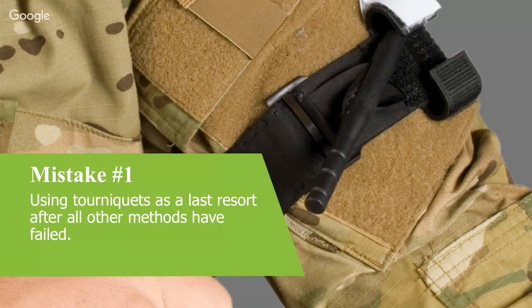And some guidance that I used to give to the medics who I worked with was, if you're even thinking tourniquet, then use it. If you're looking at something that's just hosing blood, then get straight on and use a tourniquet. The caveat being if it's amenable to, so on a limb low enough down to get a tourniquet above it. Yeah. But if you're thinking it, you should probably use it.